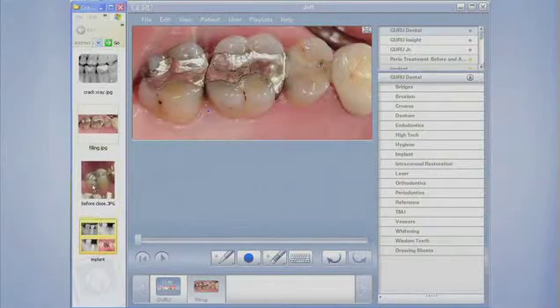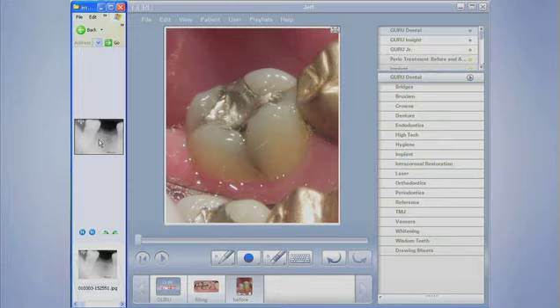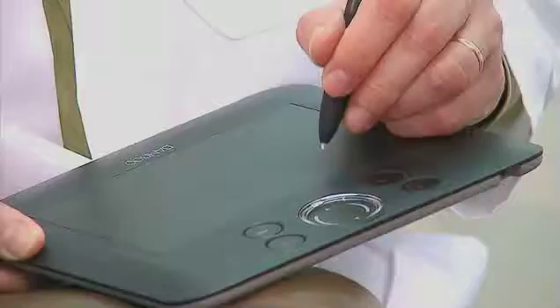Now, Chris, I know that you were talking earlier to me about the ease of use of Guru. You want to explain it to everybody else, please? Yeah, what was easy right from the beginning was the install. The install was so simple. Second, within about half an hour, our team was up and running. Everybody on my team knew how to use Guru at its basic level. You simply drag and drop to import your patient's actual intraoral images and digital x-rays into Guru's patient management system. Guru's unique stop, draw, and teach feature lets you point out areas of concern with a writing stylus or a mouse.